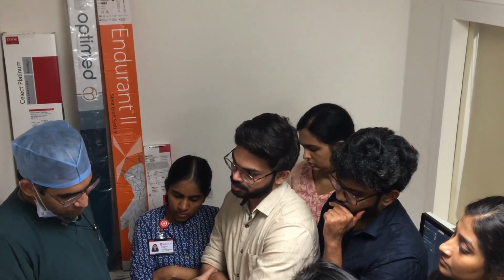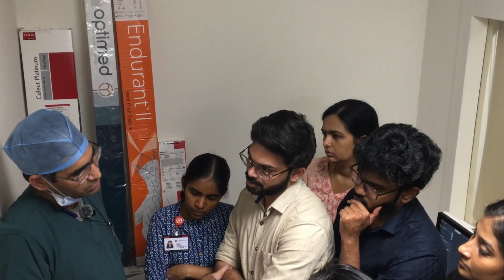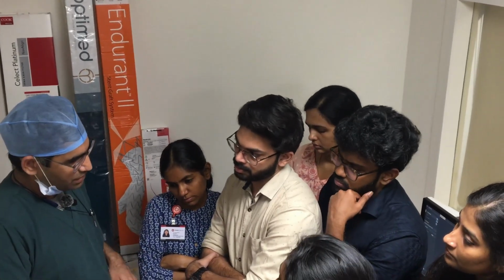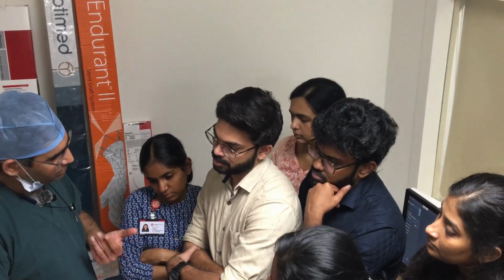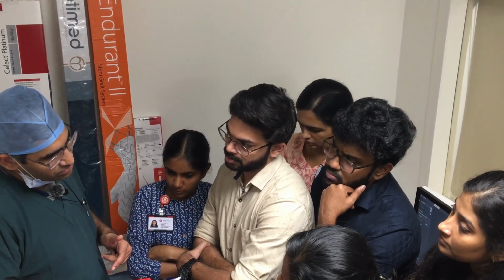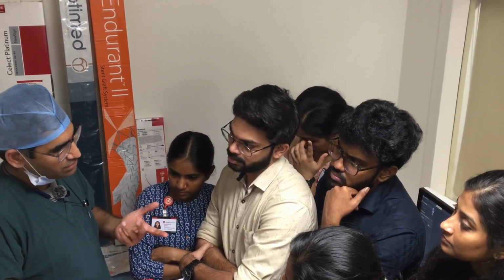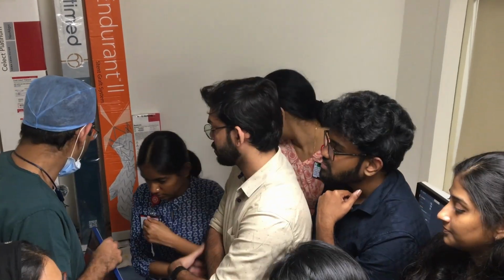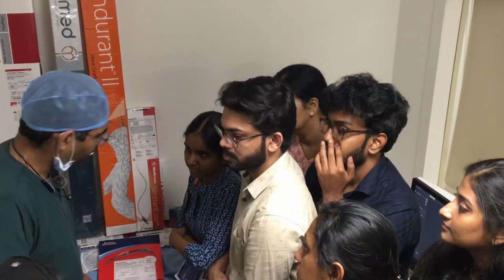Why don't we want a balloon to burst inside a vessel? Because it will injure the artery. Okay, depending on how the balloon ruptures. There are many ways a balloon can rupture, which is unpredictable. So there are certain ruptures which are dangerous. If the artery ruptures, it will keep on bleeding. So any questions at this point?